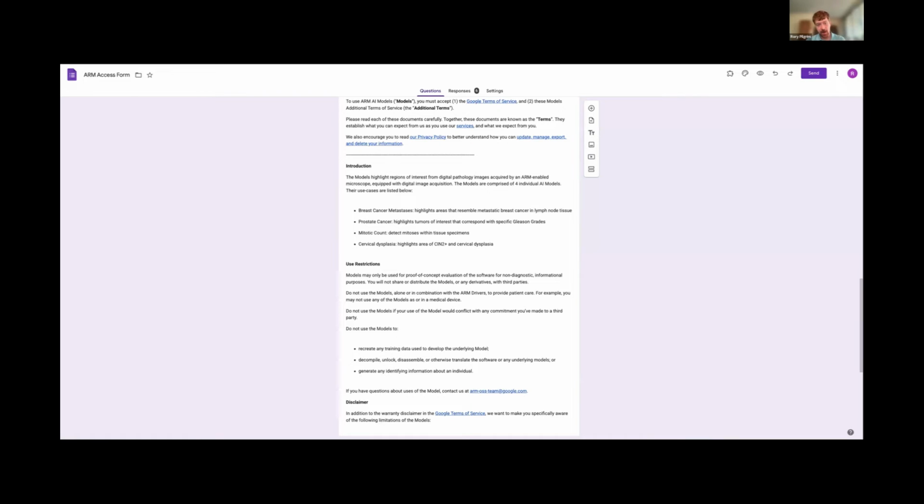Yeah, so it's now in the hundreds kind of thing. And the trick with this is we talk about patches when we train the model, it's trained on a patch level basis. So not the whole slide image, but a very small patch.